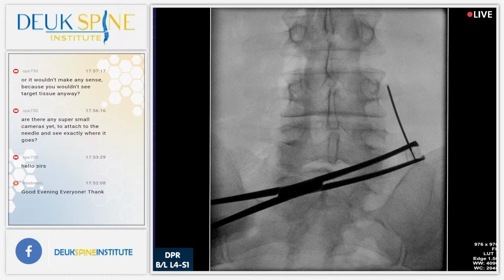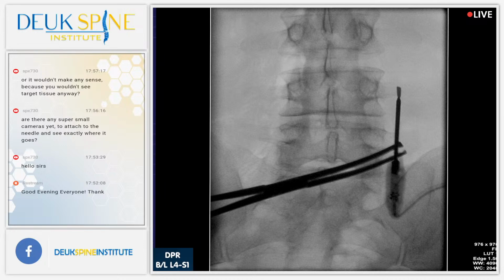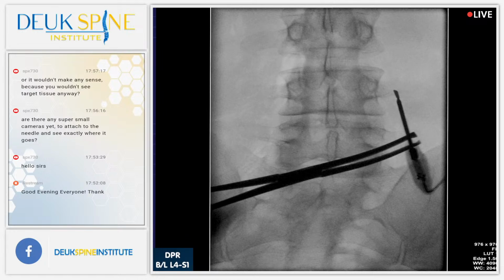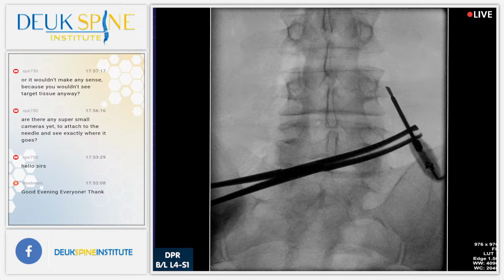Yeah, great question. I don't know if there are super small cams, but you need to use the X-ray because everything is localized based on the bone, the bony anatomy of the patient. So with a small camera, you would just see blood and muscle. You really wouldn't see what you need to see to do the procedure, which is the X-ray. The X-ray gives us the point of contact where we need our target point. Like right where I am right now. I think it would be interesting to see with the camera, but it wouldn't change how I did the surgery using the X-ray machine.